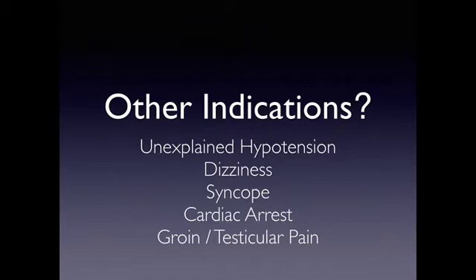So just have a really high suspicion for these type of things, because you never know where the aneurysm is on the abdominal aorta. The majority of aneurysms are infrarenal. However, anywhere along the aorta they can occur, and based on the different fibers that run along there, there can be referred pain to different areas, and so it can get tricky, like I said, to figure out what's going on.